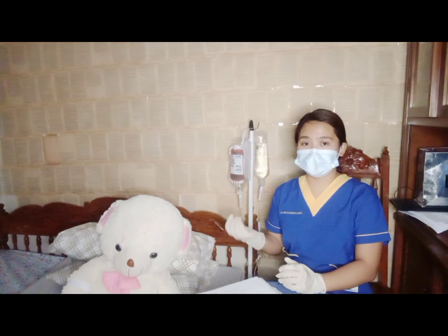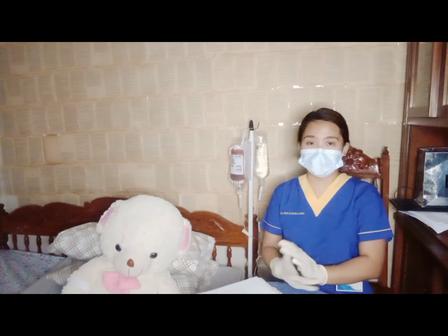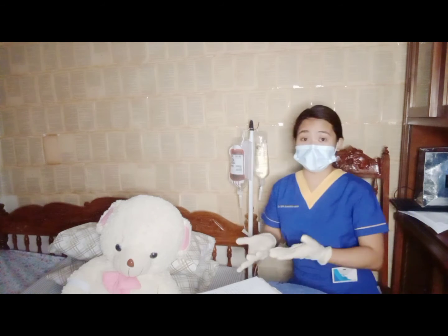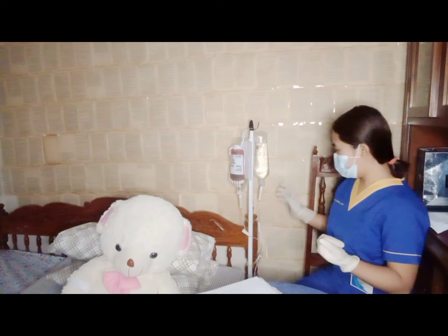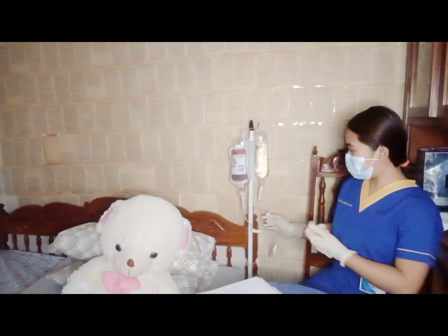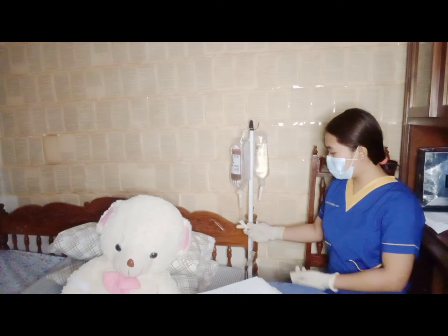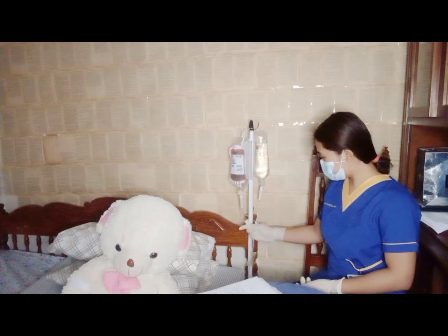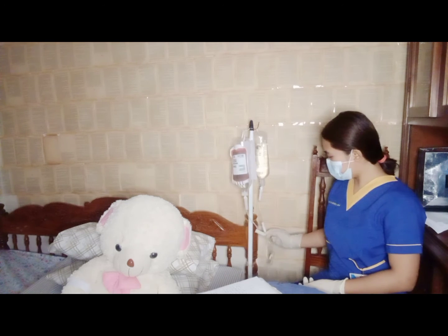After, or if the transfusion is complete, so assume that the blood transfusion is finished, let's close the clamp sa ating blood product. Okay, ayan.